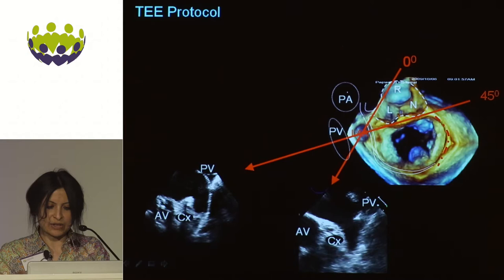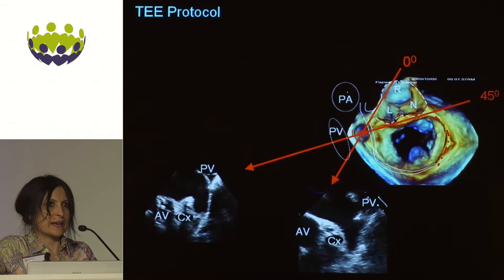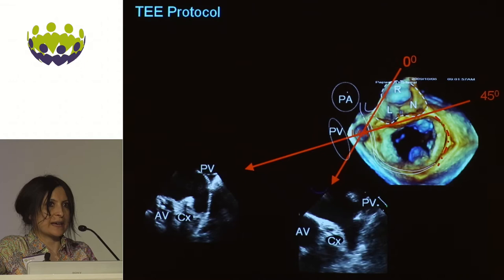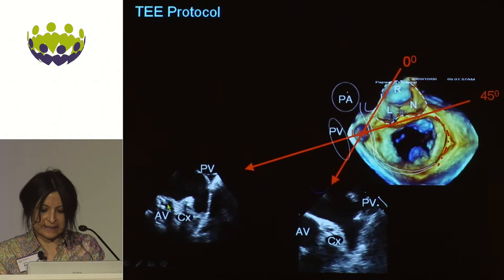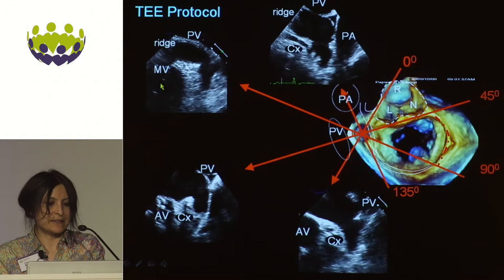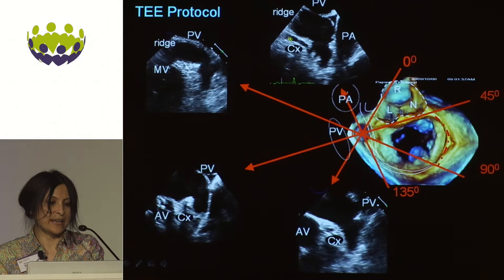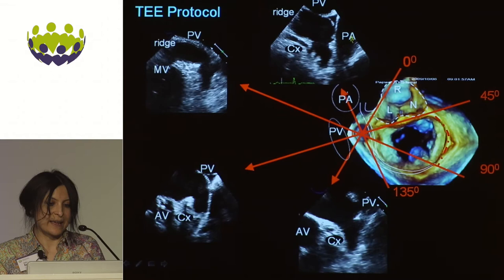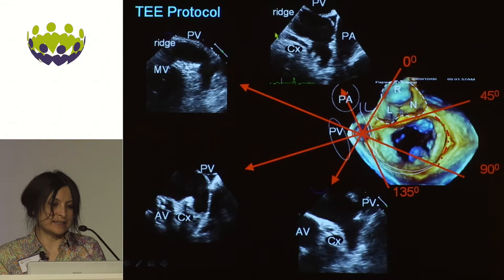At 45 degrees you again have the circumflex in cross-section, the aortic valve beginning to disappear, and your warfarin ridge nicely seen with the left upper pulmonary vein. At 90 degrees you begin to see the ridge in long axis, the pulmonary vein lengthening and opening, and part of the mitral valve comes into view. The final key view, particularly during deployment, is your 135 view — looking more anteriorly. This is often where you see the most anterior and usually the longest lobe of the appendage. You see the circumflex now in long axis opened up, the pulmonary vein above with the long warfarin ridge, and the pulmonary artery, which tells you this is anterior.